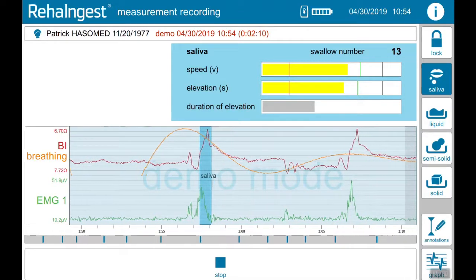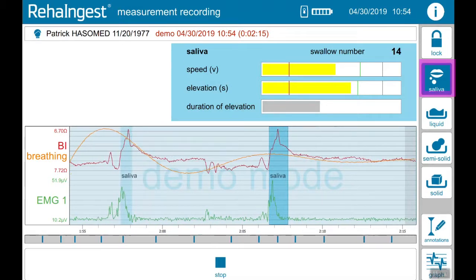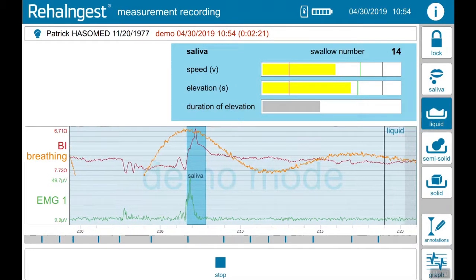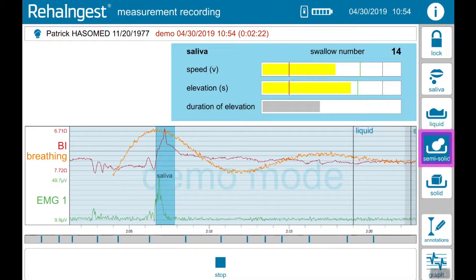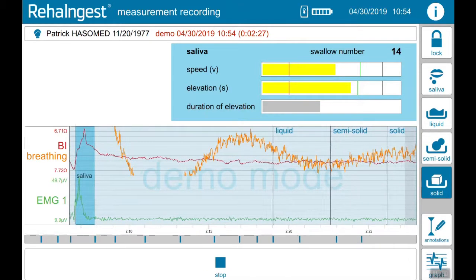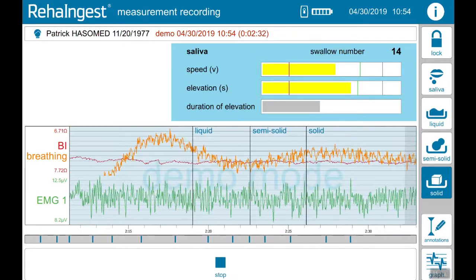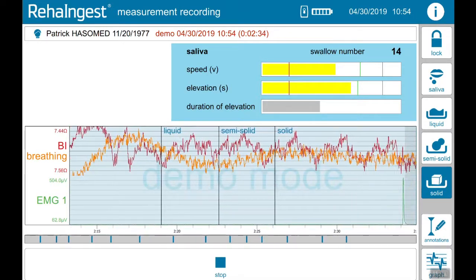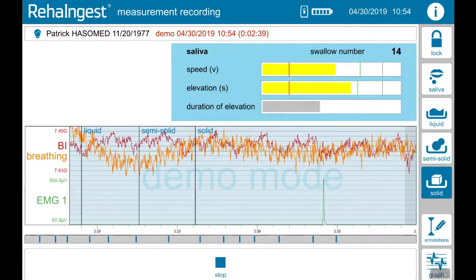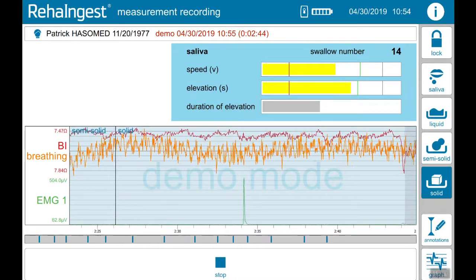On the top right-hand side you can make annotations like saliva, liquid, semi-solid and solid. It is important to set up the correct annotation, because the rating of elevation, speed and duration of the swallow depends on it. You can change these annotations at any time.